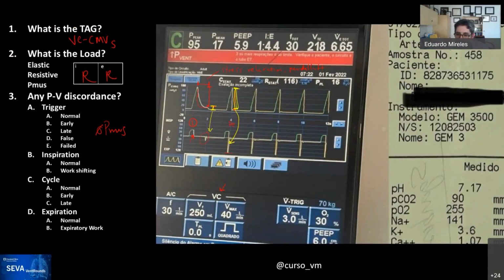Very good. And again, that was just for a 2-compartment lung with 2 different time constants. The time constant can vary, obviously, by either having different resistances or different compliances, with the other thing being equal.